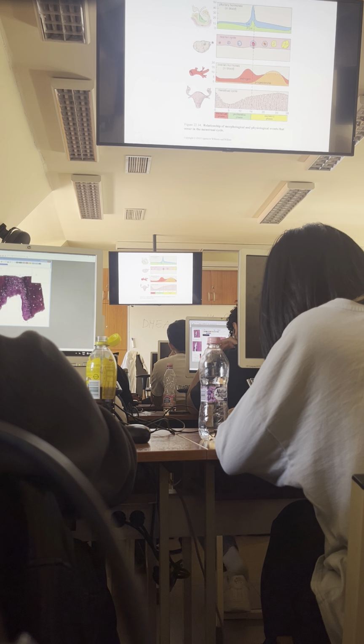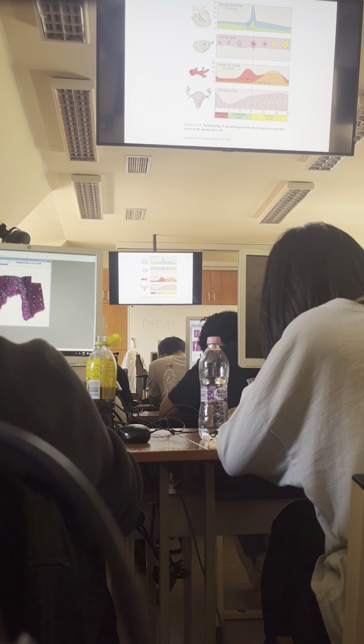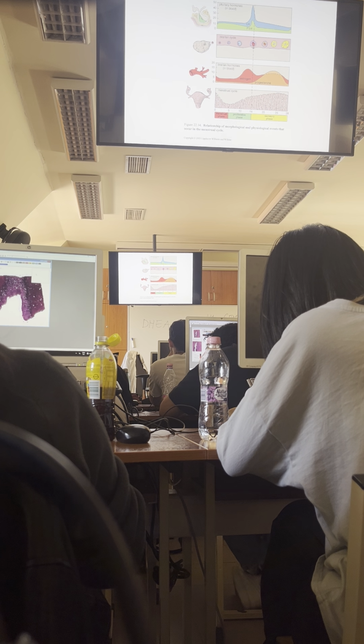So endometrium is nothing else than the mucosa of the uterus. And this mucosa is incomplete because there is no muscularis mucosae, okay? So endometrium consists of an epithelial layer and the lamina propria, but we don't use this term lamina propria in relation to the uterus. We will use other terms.